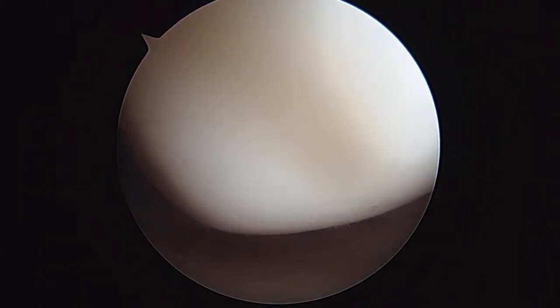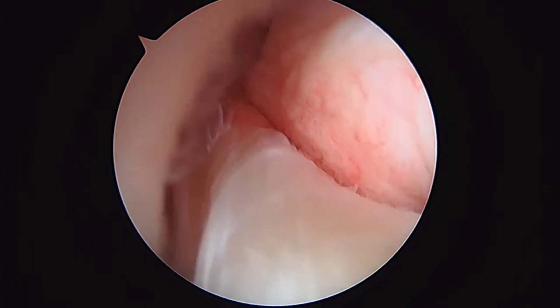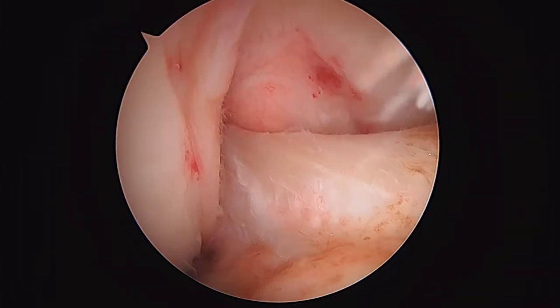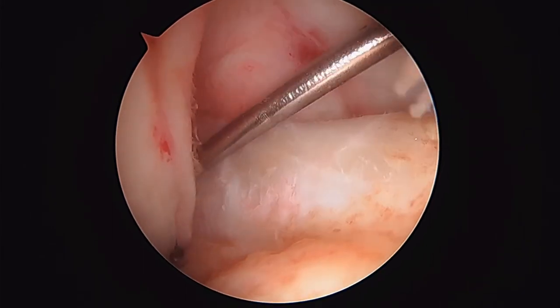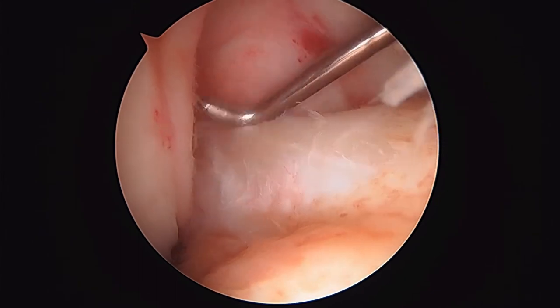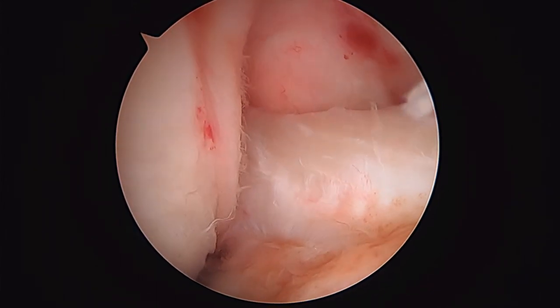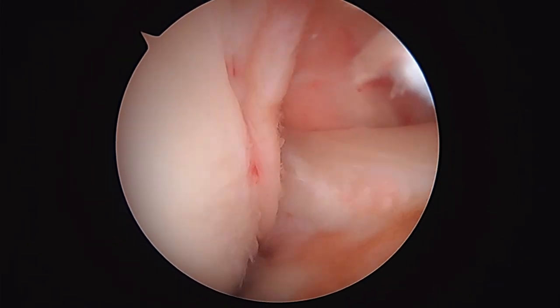We're taking our last look inside the knee. I was just looking at the ACL, making sure it had good tension on it. It's certainly running in the proper direction. When I do a dynamic stress test, it tightens up, as you see. So we're going to finish up here — good luck to you.